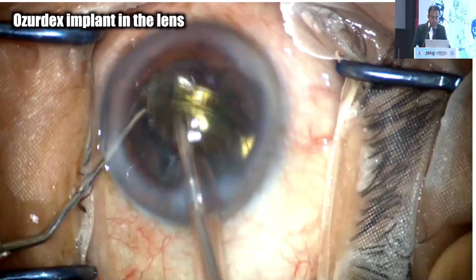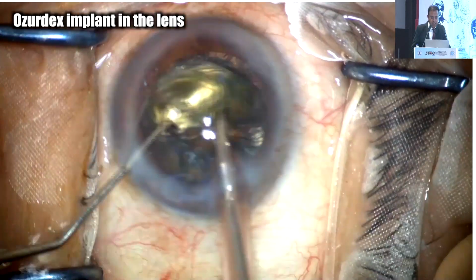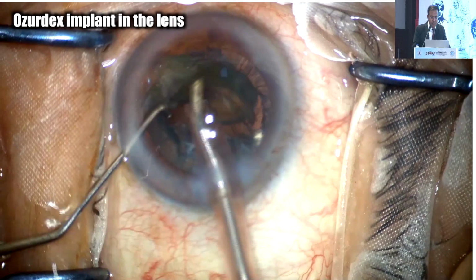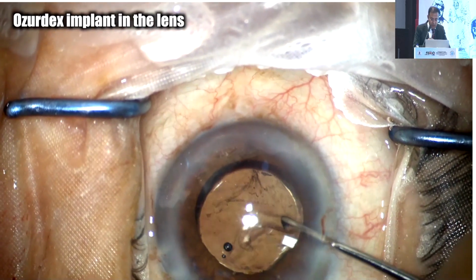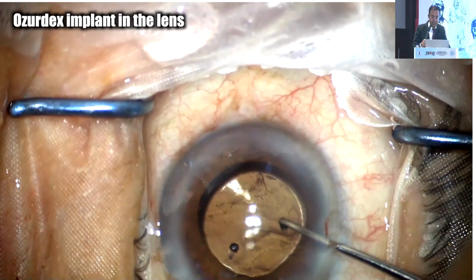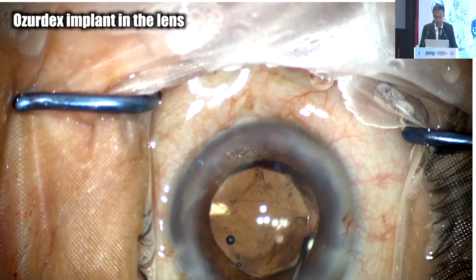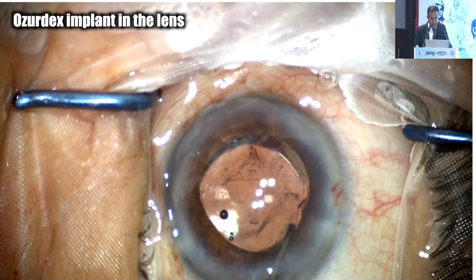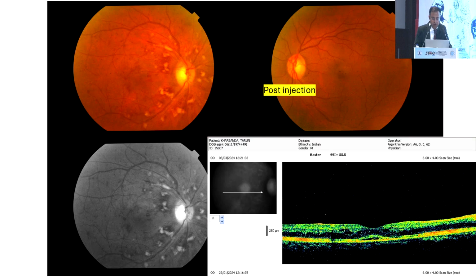I'll just show you this, we are removing the cataractous lens, and you just see this. Now the Ozurdex bullet has gone inside. I was planning to remove it, but then I shoved it inside the vitreous cavity because the patient was a diabetic, and that was the indication for using it, and the surgery went fine. So we have various indications like CRVO with CME, and now this patient got Razumab.